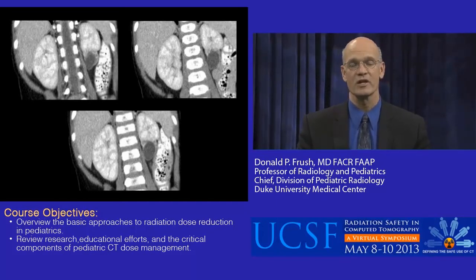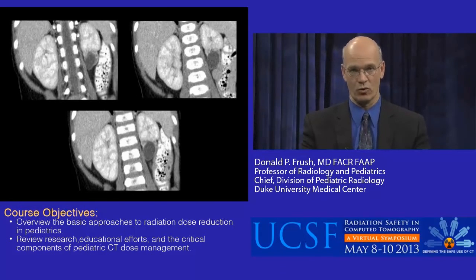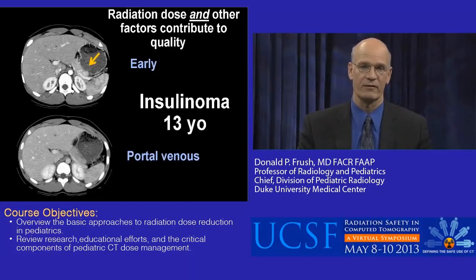And so we did this in about 1.5 times the normal exposure or normal dose estimate that would have resulted from this examination. And in fact, we got 3 phases of information. And on coronal reconstructions, I think you can nicely see images displayed here from the nephrographic phase. This ended up being a somewhat unusual regional multicystic dysplastic kidney. It did not need to go to the operating room. These regress on their own, and so we got very useful information, and we're able to target the multiphase examination.